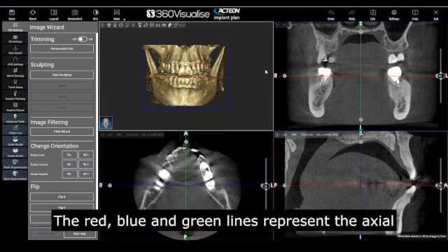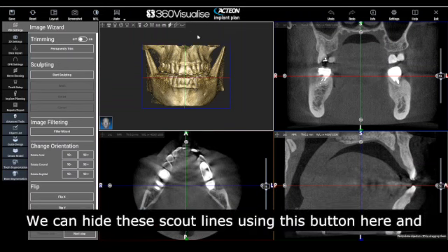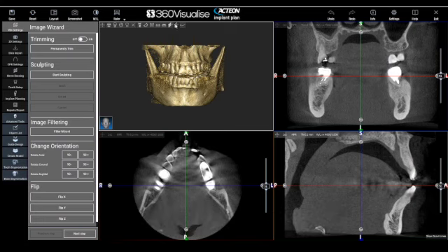The red, blue, and green lines represent the axial, coronal, and sagittal views shown in the other windows. We can hide these scout lines using this button here, and show them by clicking this button.